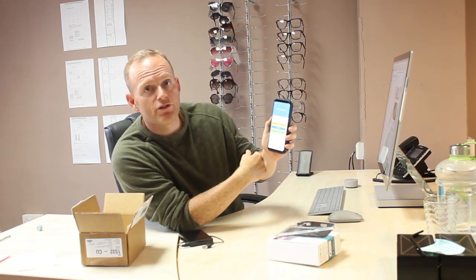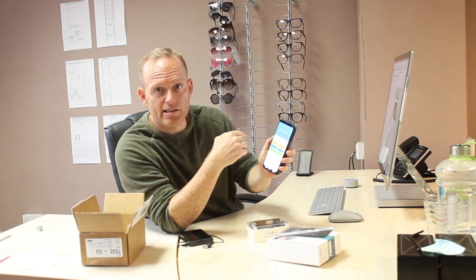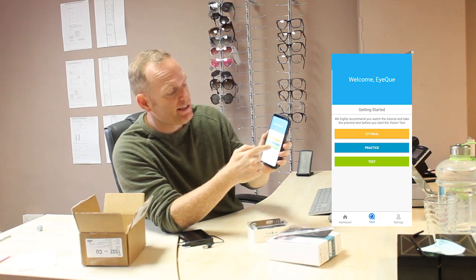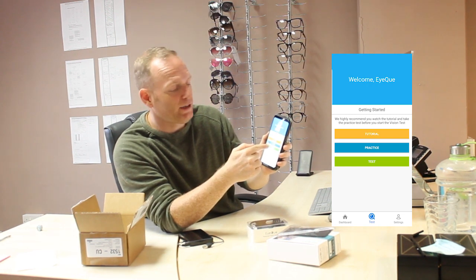Just opening the app up — so if we move from the dashboard where all my prescription details are, we press Test, then we've got a number of different options. We can run the tutorial, which teaches you how to do it and what you're going to see when you're looking inside the scope. Then you can have a practice, and you can run through it, or then you can press Test.